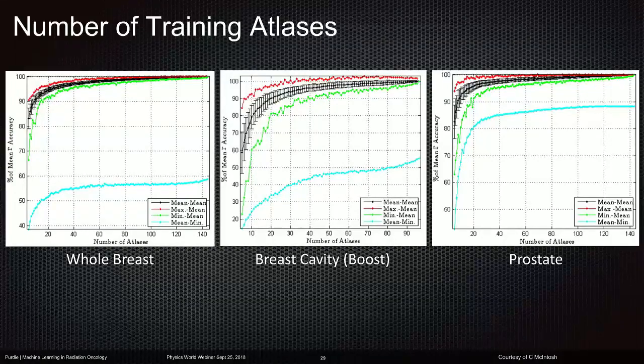One thing that always comes up when we talk about trying to find patient matches is knowing the number of patients we need to train on. I think the universal answer here is there is no way to absolutely know how many patients you need, and typically more patients are better, but within a certain limit. So what we did was take a look at the ability to match two patients using, again, probably a terrible metric because it's too strict, the gamma metric, to compare two dose distributions and how well one patient can predict for another.